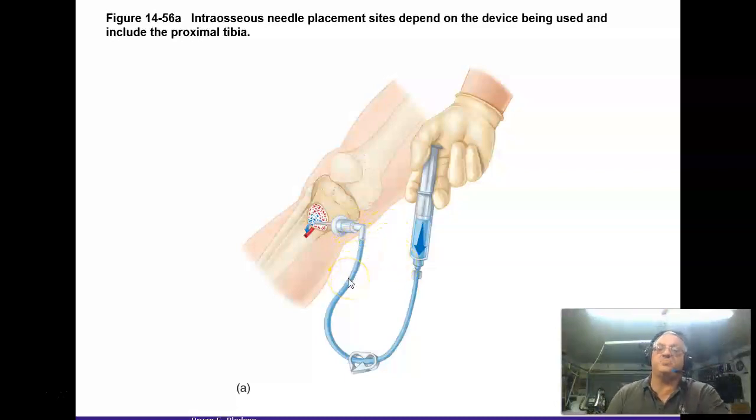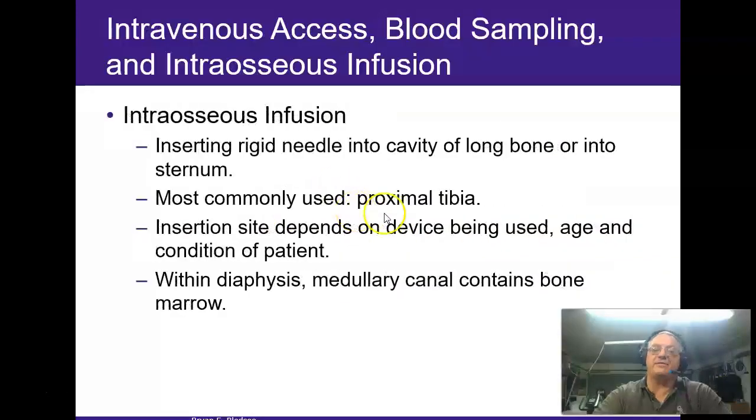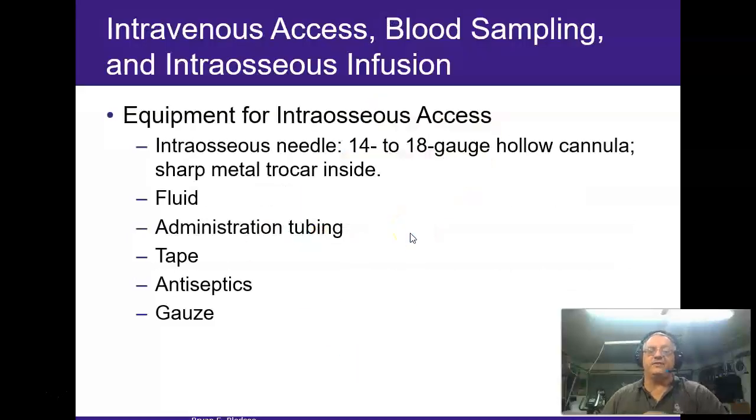Your first push, by the way, should be extremely hard, okay? Because sometimes it is required in order to open up that canal to where it will actually start to flow fluids, okay? Also, just because you're in there doesn't mean you're going to be able to draw back and get anything back out of there, okay? Again, we've already gone over this in class, and it's usually a 14 and 18 gauge hollow needle.